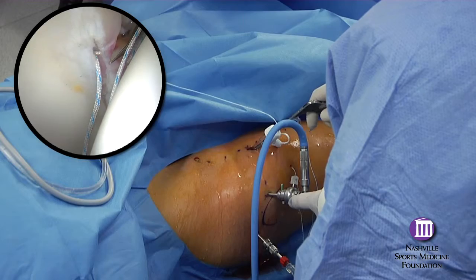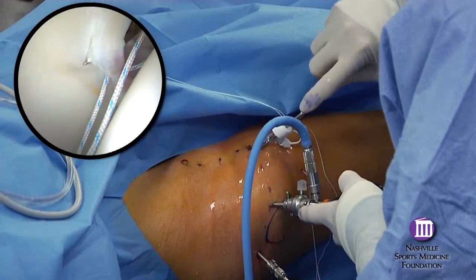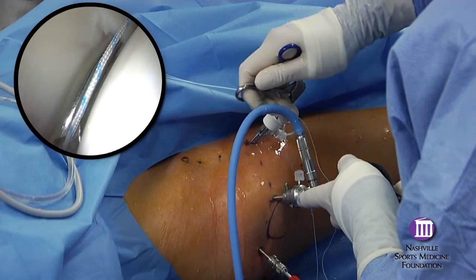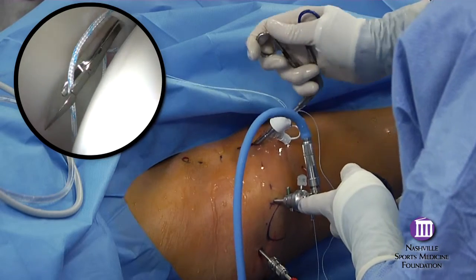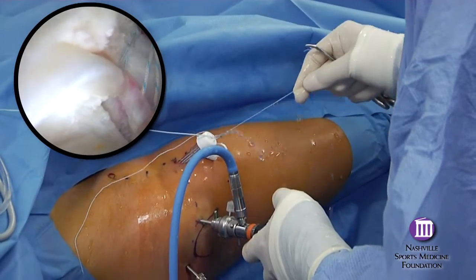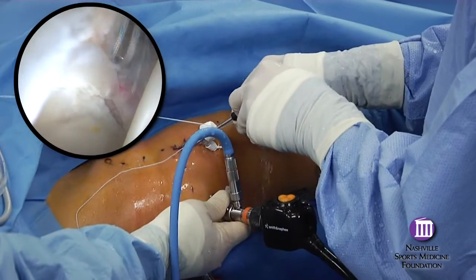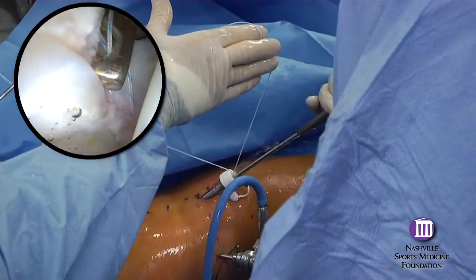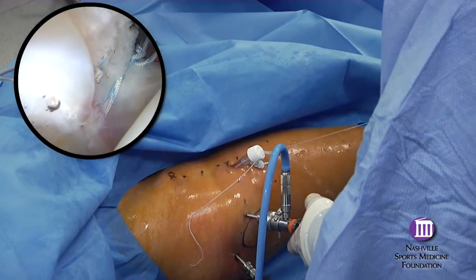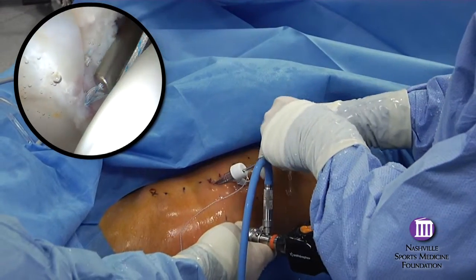Suture management is still best accomplished from the anterior portal. This time, passage of the suture is accomplished in a single step with a soft tissue penetrating device. Mattress sutures are preferable for a primary repair in order to avoid suture interposed between the labrum and the articular surface of the femoral head. However, the more paramount issue is to assure that good substance of tissue is being re-approximated, and may sometimes require the suture to simply be looped around the labrum.